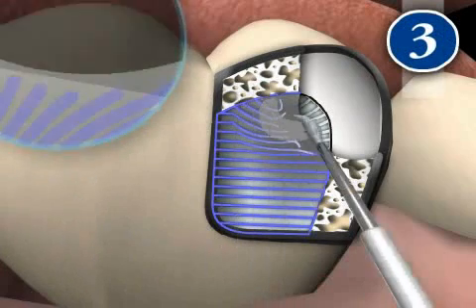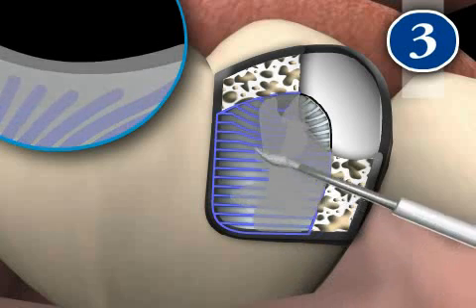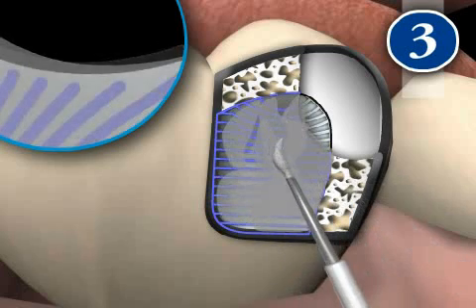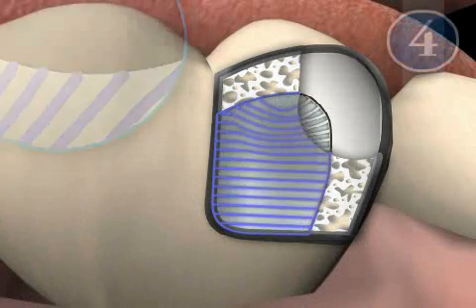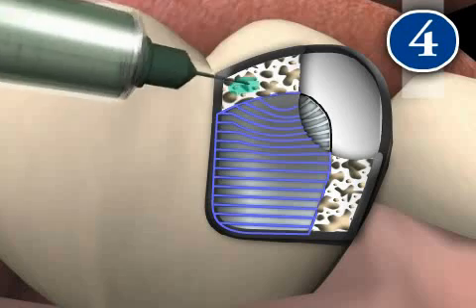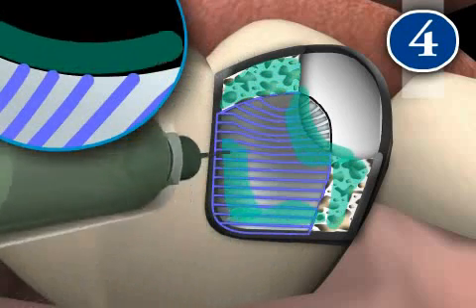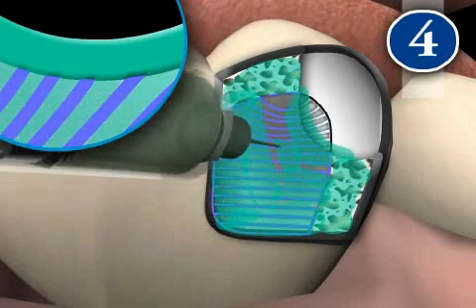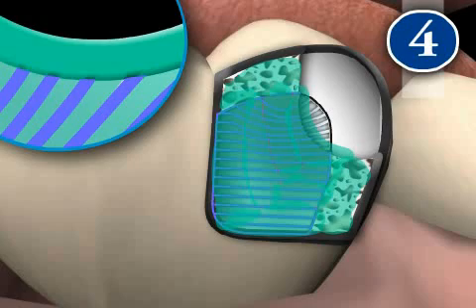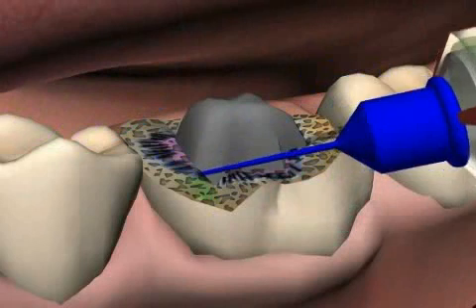Step 3 is the adhesive. Although the protein strands are dry now, they have collapsed. The adhesive makes the protein strands stand up again, thus promoting the distribution of the glue. Step 4 is the bonding. The bonder is the pre-glue. Since it's very thin, it penetrates deeply into the cleaned and re-established protein strands of the dentin, and into the vacuoles and caverns of the dentin. Finally, the actual glue is applied.